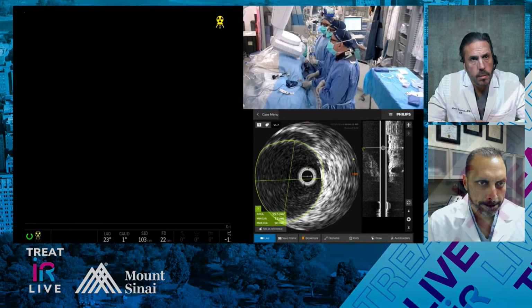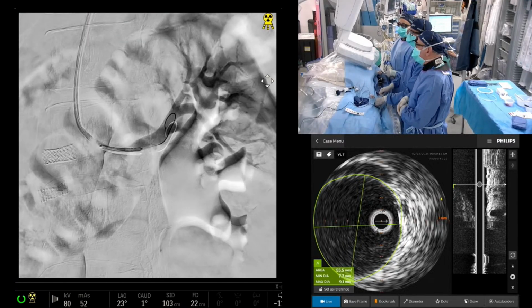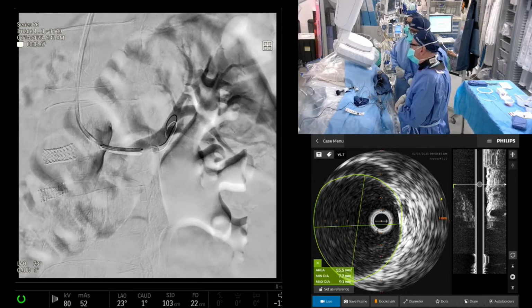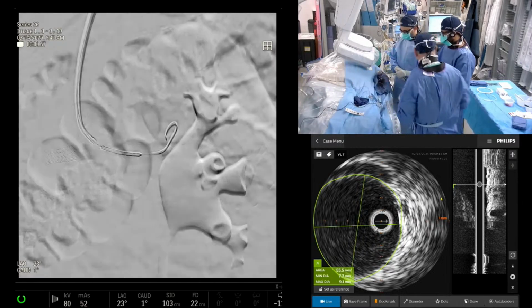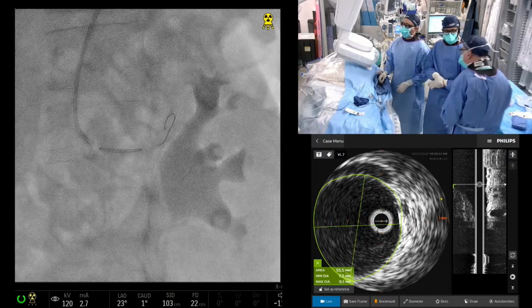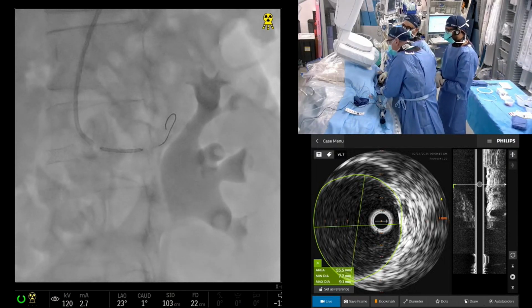Ready? Mm-hmm. A little bit further. That is actually, I like that a lot, actually. Okay. No, I really like that. I think that's perfect. I think it's pretty good. I think Rahul wanted to pull it back 1 millimeter. I could tell. I know. I saw that look on his face, and I said, I really, really want it there.